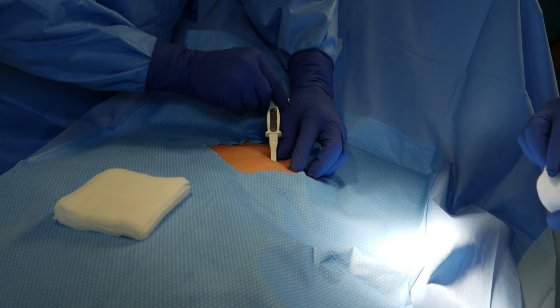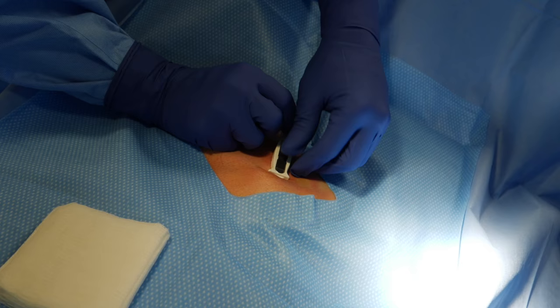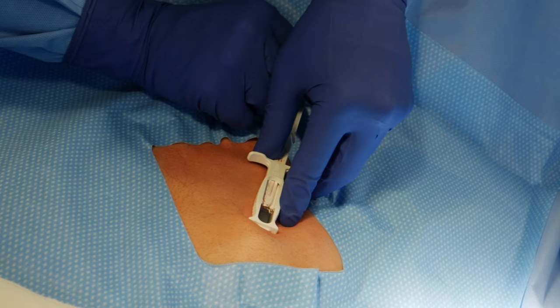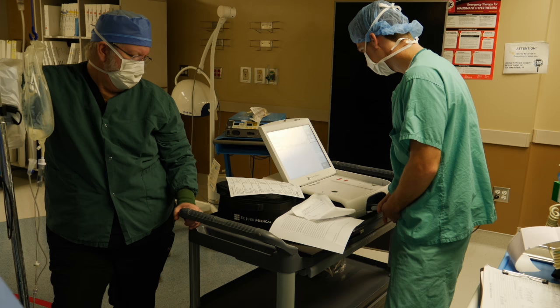With the insertion tool we can slip it down along the anesthetized track that we created, allowing us to implant the loop recorder. That's it in gray at the base of the insertion tool. We pull back the plunger, watch the loop recorder drop into the delivery cartridge, and after we see that, by advancing the plunger, we position the loop recorder underneath the skin. We then remove the insertion tool and use a finger to control any bleeding, and the loop recorder is implanted.